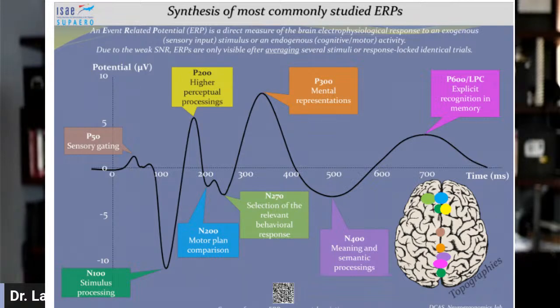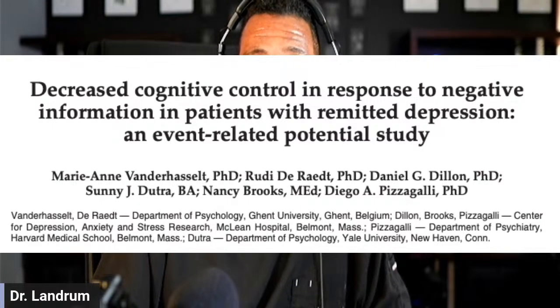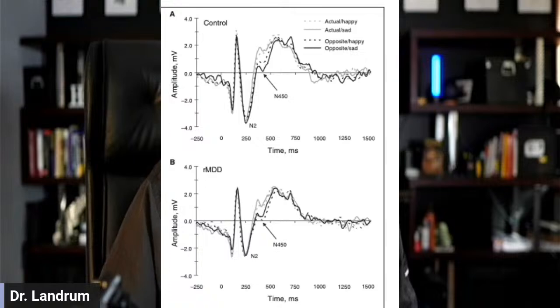And so that paper that was referenced earlier allows us to understand depression even better, because what we're able to see is this waveform that I was referencing previously at the top as a control, and down here are patients that have depression. And what we can see is differences in terms of the peak as well as the onset for different components of this waveform that then lets us make a determination. Is this person having depression in addition to what they feel?